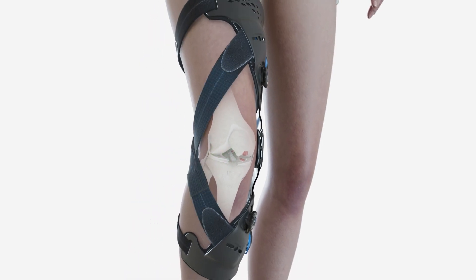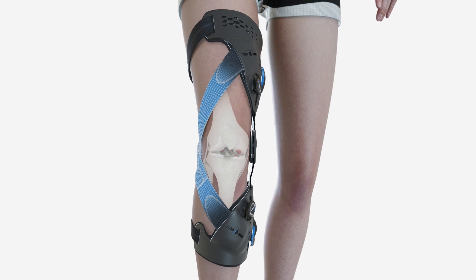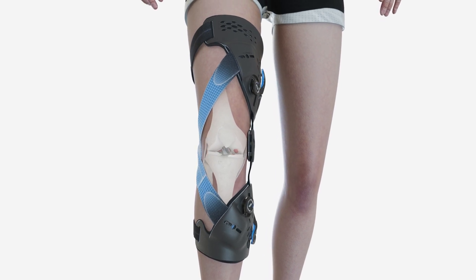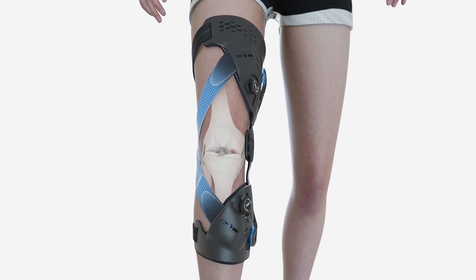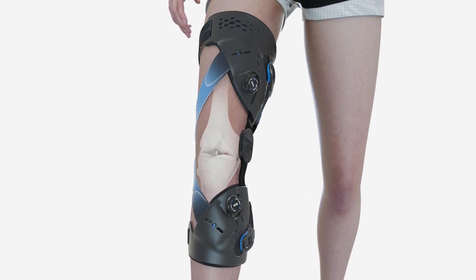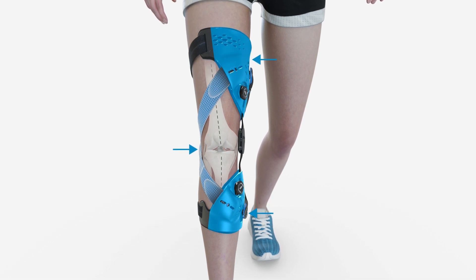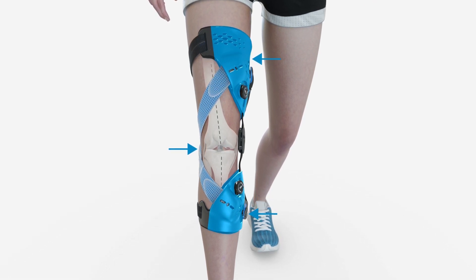The three points of leverage come from the dynamic force straps working in conjunction with the shells to provide a gentle pulling force to reduce the load at the joint surface. The force is spread across a large surface area to reduce pressure points. It is a dynamic force that increases as the joint gets closer to full extension, as this is when the greatest load is incurred.